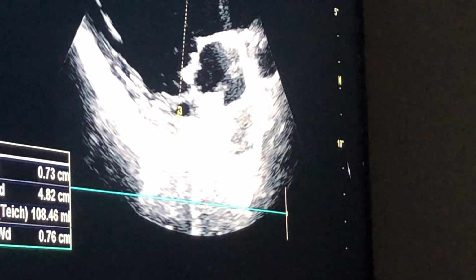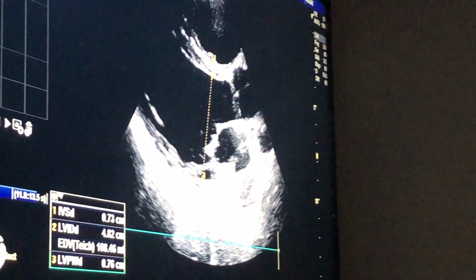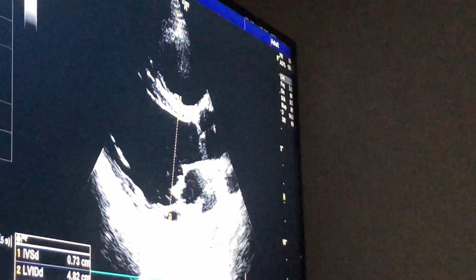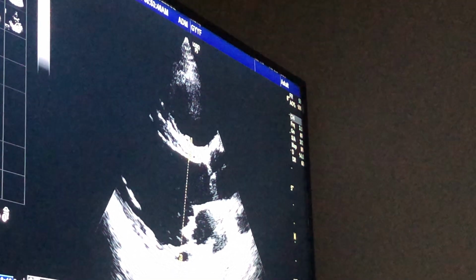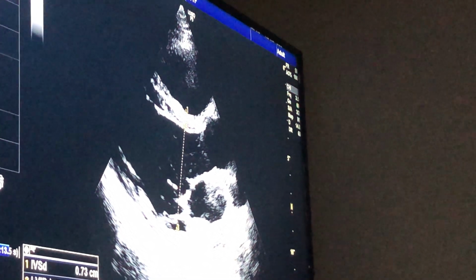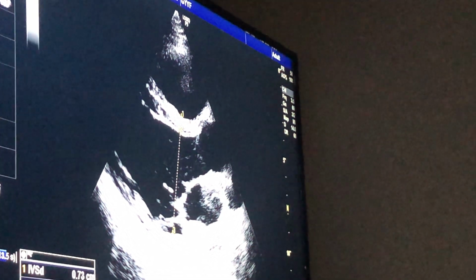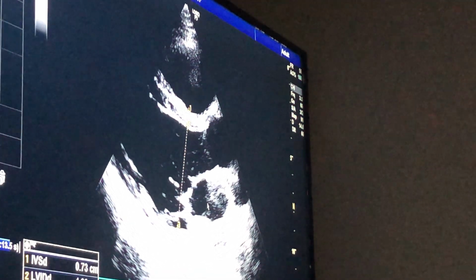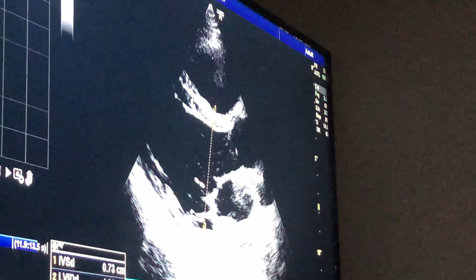So we're now wanting this aorta to open. Got it? Because the blood that's in here, we want it to leave. Remember, we're still part of that one heartbeat. So I'm going to open it. You guys saw it fly open, right? So we're watching it until it snaps shut. Remember, this cannot open again, okay? Because the blood that was in here is now in here. Now it started to leave when this snapped open, right?